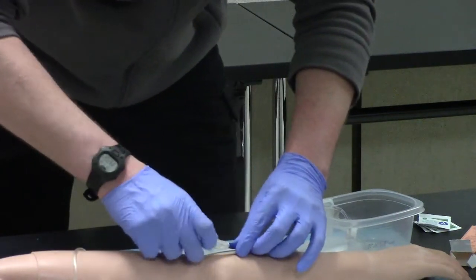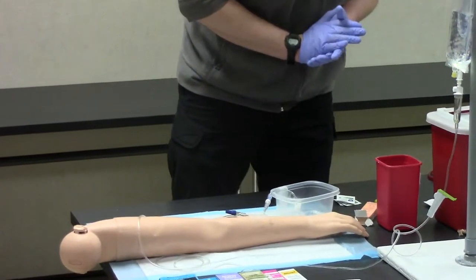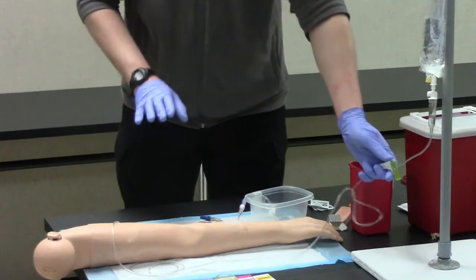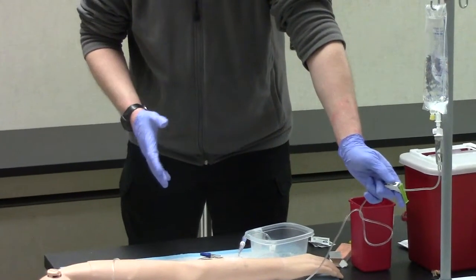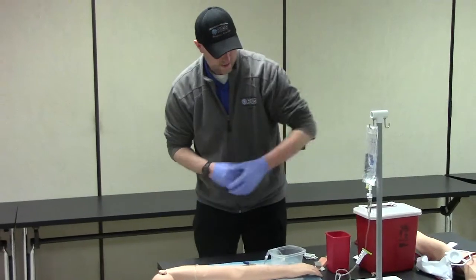So I can remove my medication and dispose of it properly, and then open up the line. Anytime you administer a medication, we always want to make sure that we flush out the line. So I'm going to flush it for about 30 seconds, and while I'm watching my patient to see if they've had any changes, after about 30 seconds of flushing, we're going to readjust the rate back down to where we want it. In this particular case, I'm going to take it back down to TKO. Make sure that I actually have TKO here.